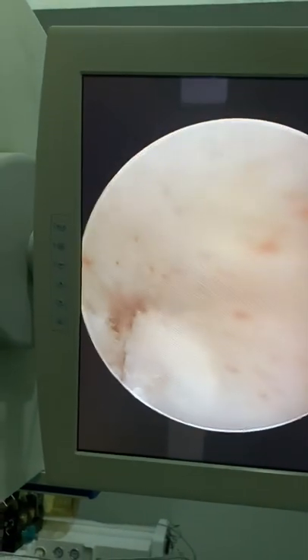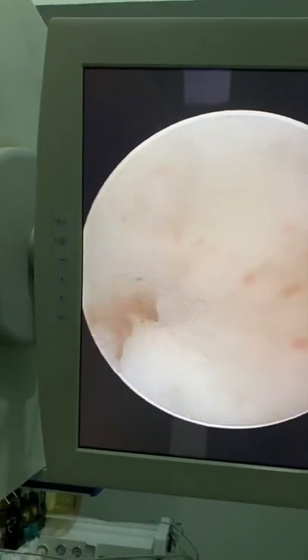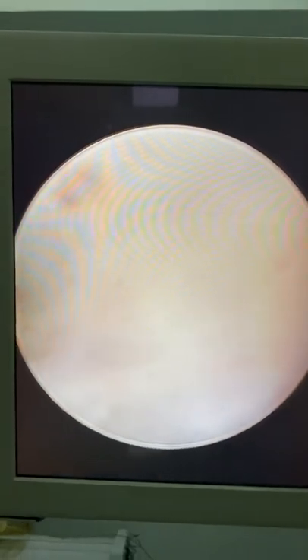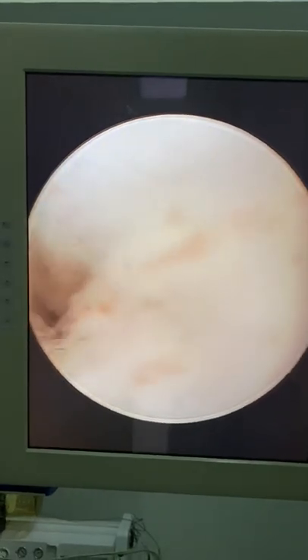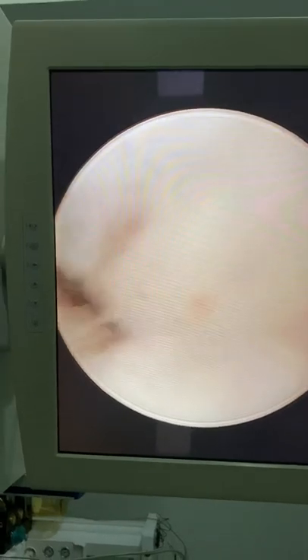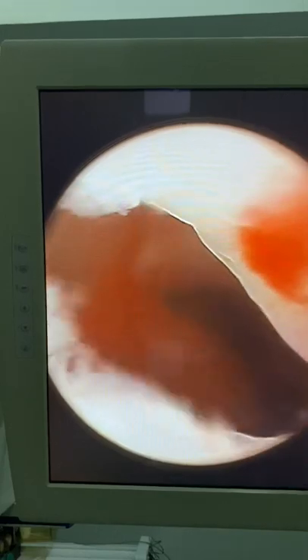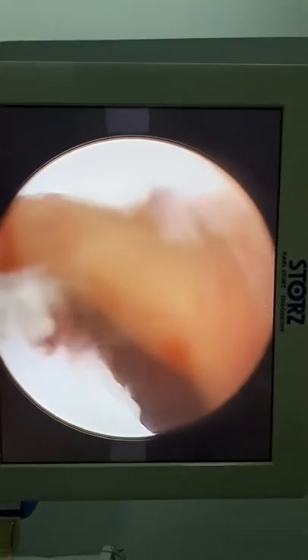Slowly in. The uterus is a little bit fixed — as I expected. I'm going through adhesions. Slowly — we have some air collection, so I'm sliding slowly in and cutting the adhesions under vision. Focus on adhesions. I'm in difficulty — there is some blood collection inside. I readjust the focus. I'm into the cavity.